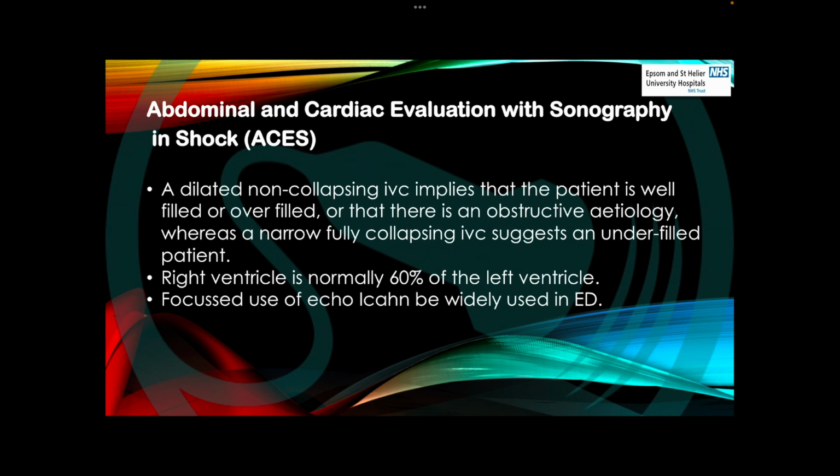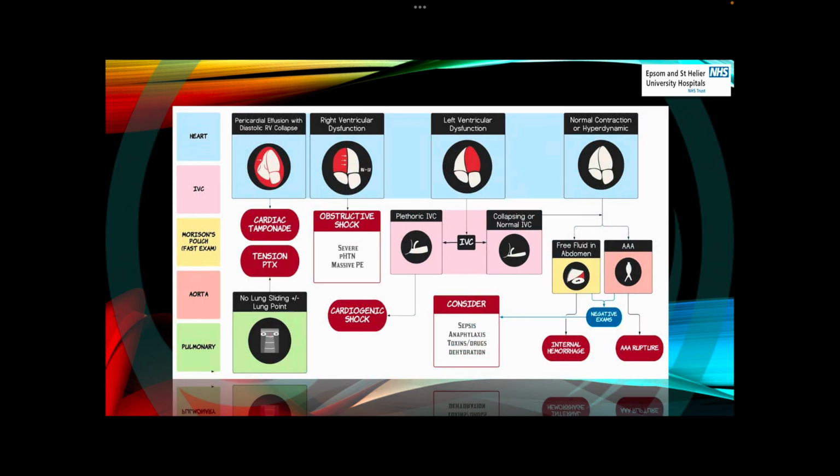Focused use of echo can be widely used in an emergency department. This is really important. So we have to make sure that our colleagues or physicians are completely trained to do echo, because it is highly informative when you are able to do it in the proper way in order to reach the final diagnosis. Here is a very nice illustration.